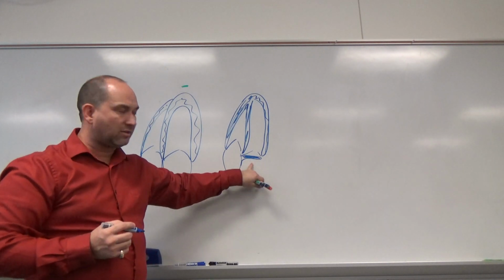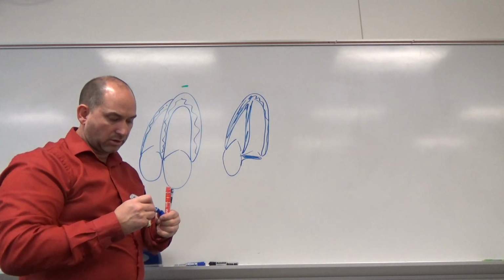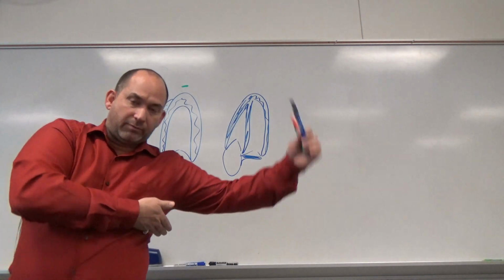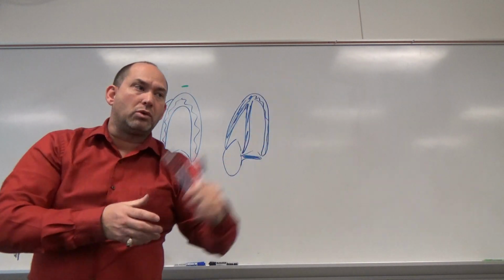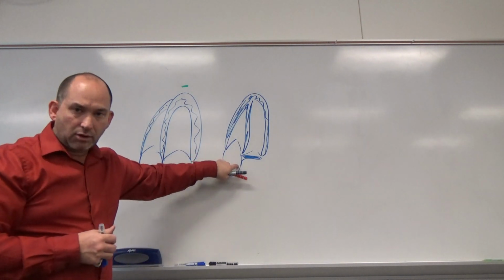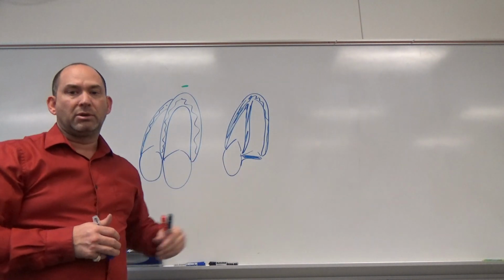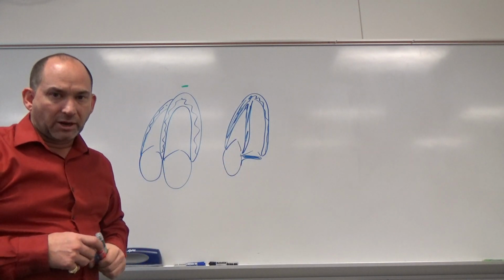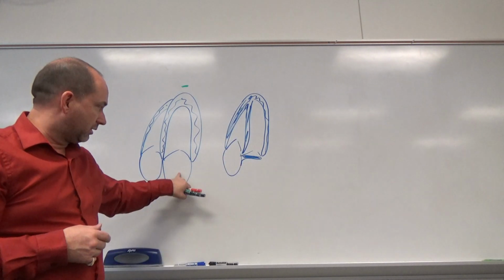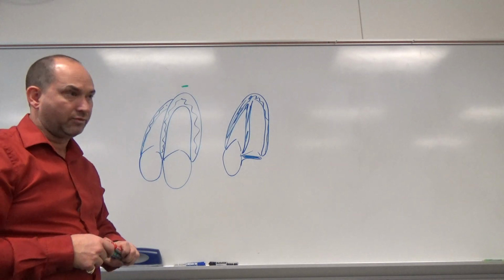But if I see this, that means that I've rotated incorrectly and I'm pointing more straight towards the floor if the patient's on their left side, and I need to counterclockwise rotate, keeping the right side open, but then also being able to get the left side open. I need to see the full atria just like this. If I don't see that, I don't have a good enough view.